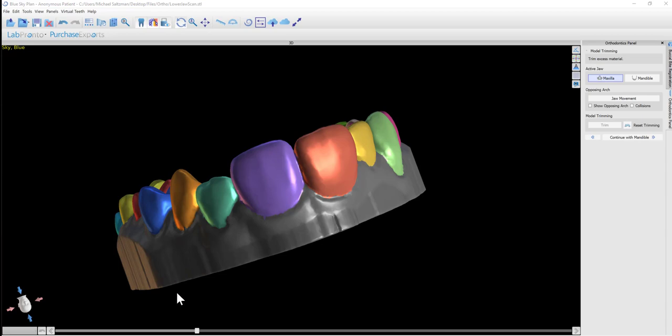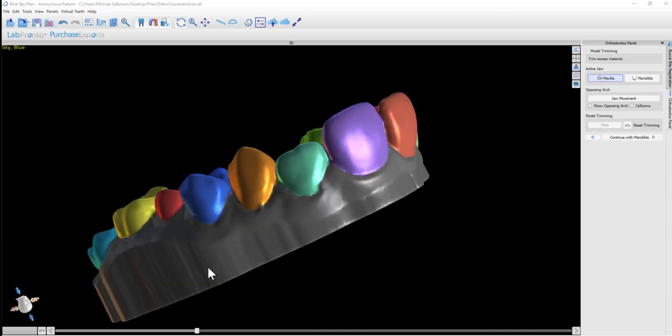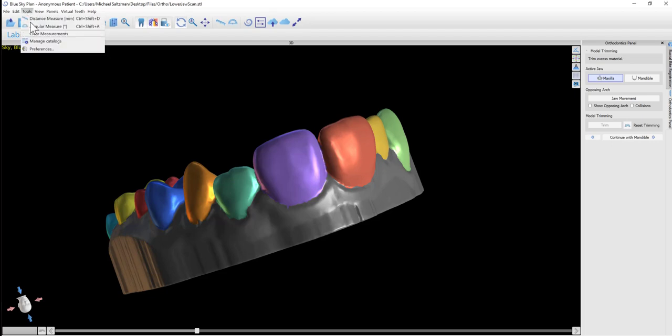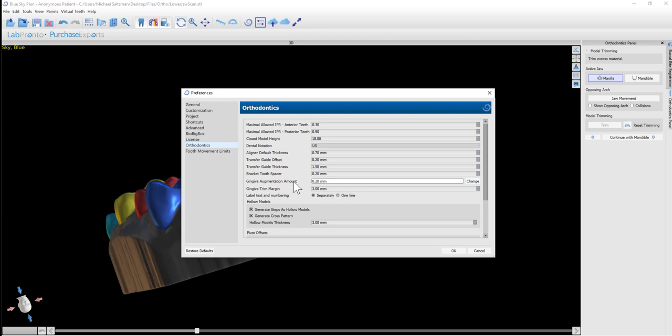In a situation where we want to completely eliminate anything below the trim curve, we can go to Tools, Preferences, and reduce the closed model height.